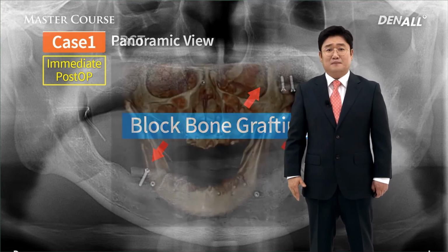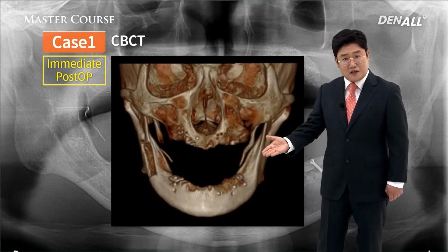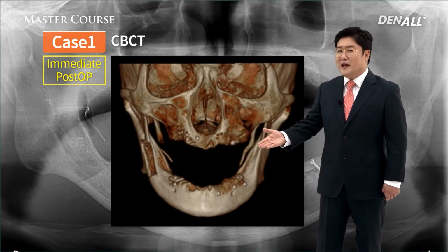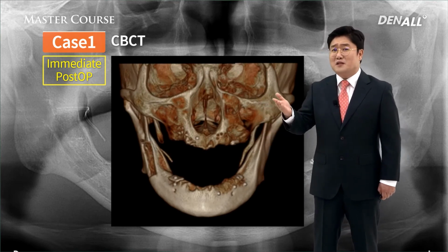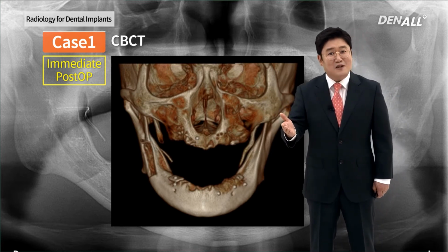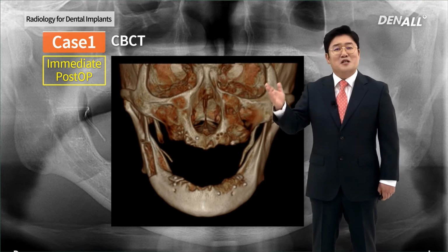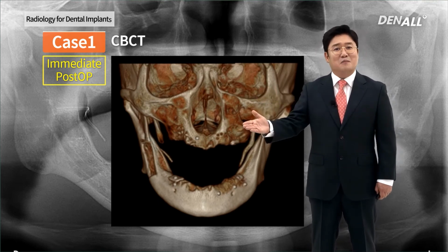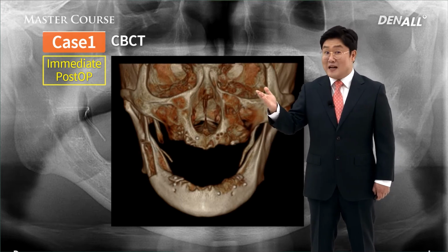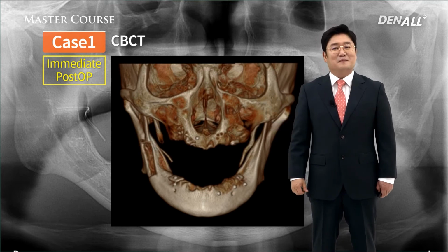The treatment outcome can be checked with CBCT as well. In the past, panorama had limitations in predicting the treatment outcome or complications. Using the CBCT, the issue was addressed and accurate evaluations can be done with the CBCT. Advancement of CBCT pushed the advancement of implantology as well.